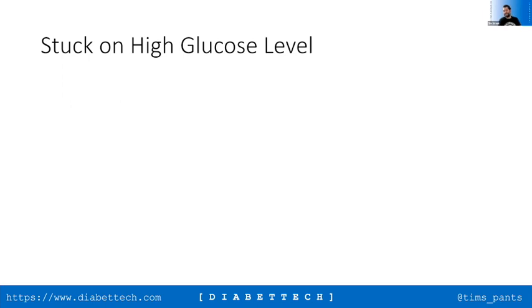Actually, it's an interesting point. I've sometimes found if I've been stuck somewhere where the glucose level is higher than I wanted, and I'm thinking it's just not correcting and coming down, I will get up off the couch or away from my desk and walk around the house once, walk outside, walk back in, and just that exercise seems to get things moving, and suddenly everything comes back into line. You don't necessarily have to go for a big run. Yeah, and I'd agree with that.